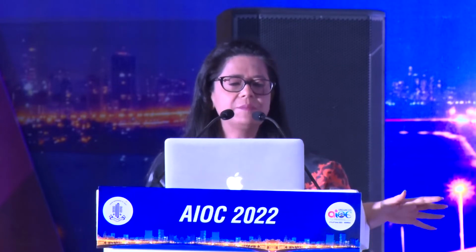The new kid on the block, a very popular lens by Alcon now, is Vivity. It works on a different principle of X-wave technology. So here there are two smooth transition elements in the center zone of the pupil, and within this zone there is a 1 micron elevated plateau. So all this stretches your wavefront and shifts the light onto an extended focal length. So the advantage of Vivity is that it doesn't have those multiple diffractive rings, so it doesn't give that much glare and halos. It's just got a central bump which you can see on the lens, and this is also working very well for distance, near and intermediate vision.